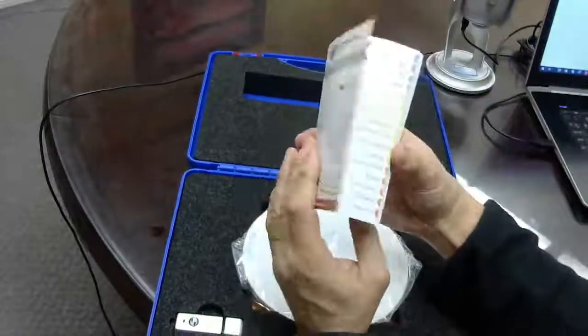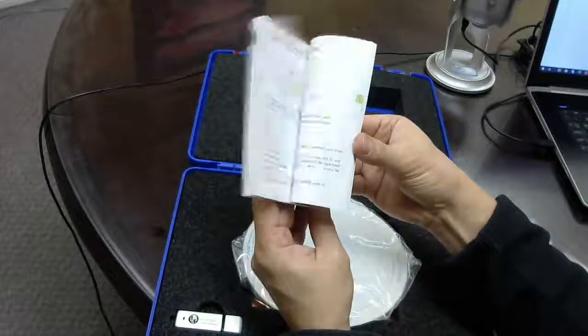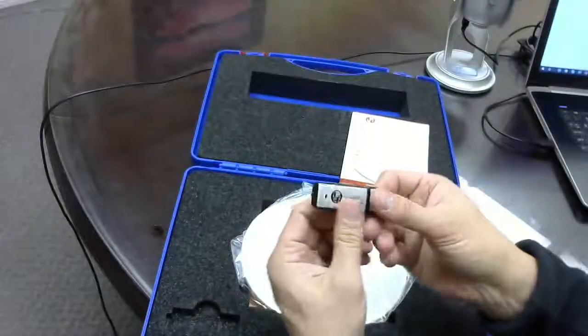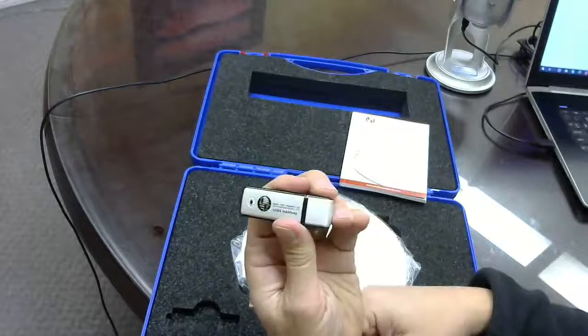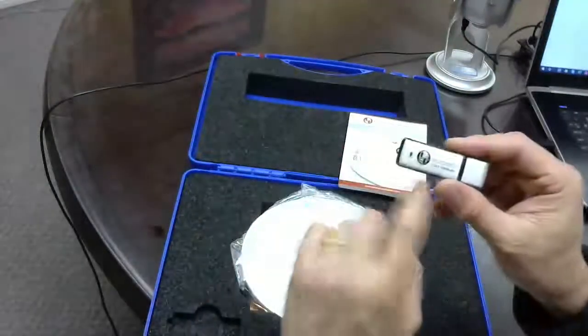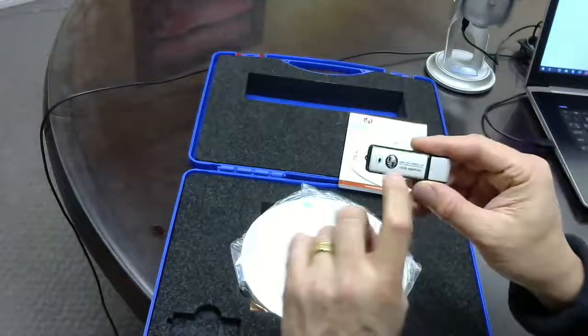It comes with kind of a mini catalog showing other products. It also comes with a USB stick with the digital catalog, and I'm assuming as well the user manual, which I'm reading right here.